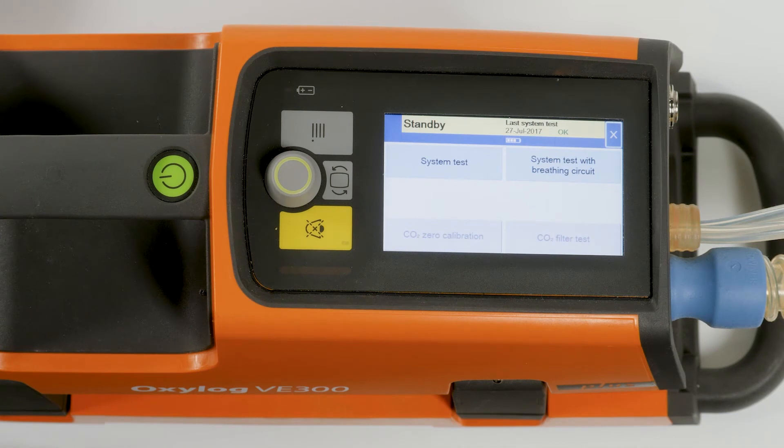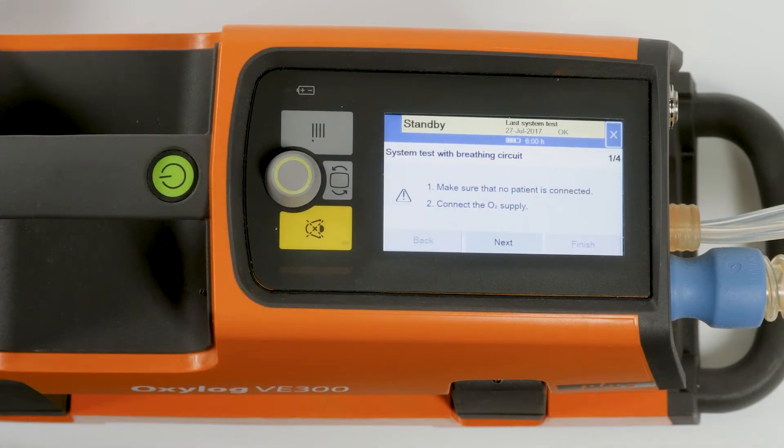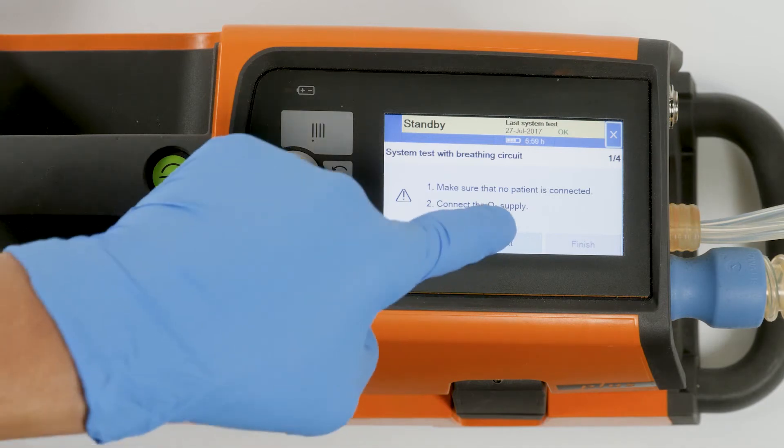Touch the button test and calibration. Using a disposable breathing circuit, touch the button system test. Using a reusable breathing circuit, touch the button system test with breathing circuit, which is shown here as an example. The system test with the breathing hose is now started. On screen one out of four, confirm the advisory messages with the next button.